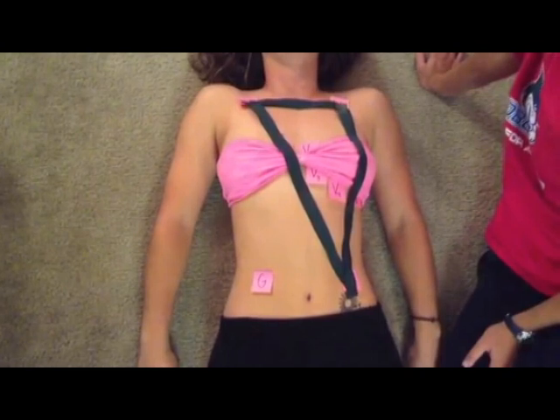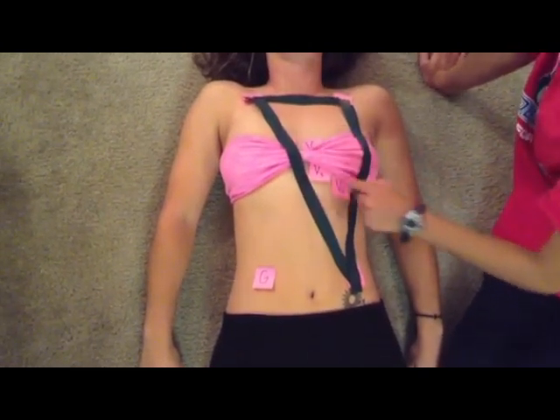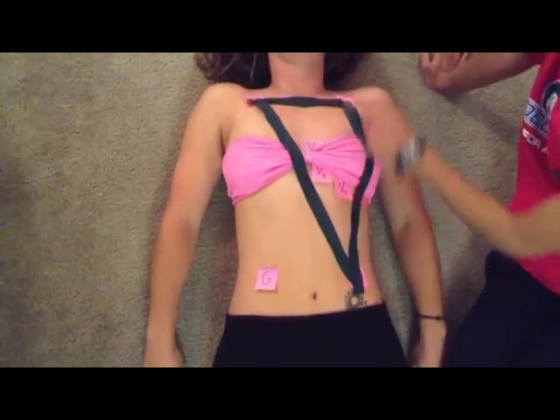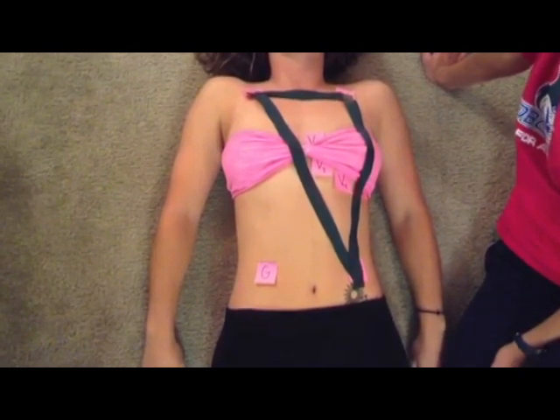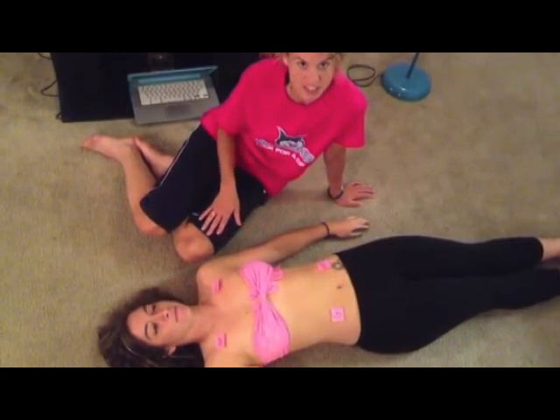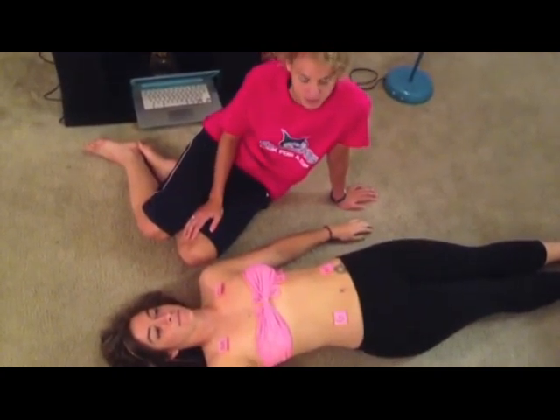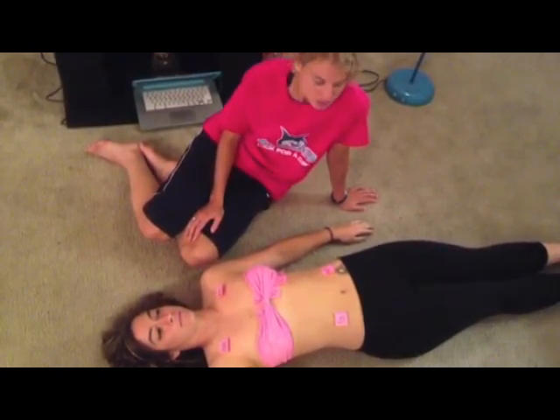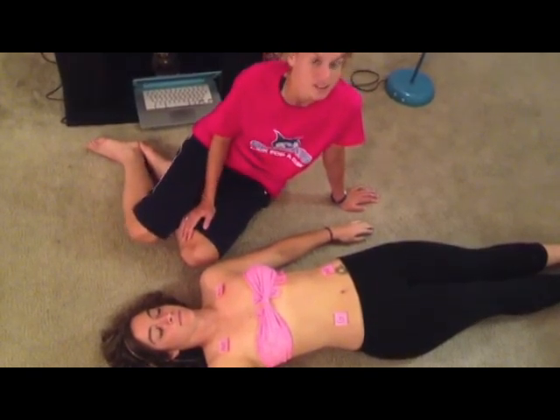Just like the resting EKG, there are 9 individual leads, in addition to Lead 1, Lead 2, and Lead 3, which complete the 12-lead EKG system. The reason we move the electrodes from the arms and legs onto the torso during exercise is to reduce the electrical artifact introduced by limb movement. In addition, it is much easier and safer for the patient, preventing the wires from getting in the way of their moving limbs.